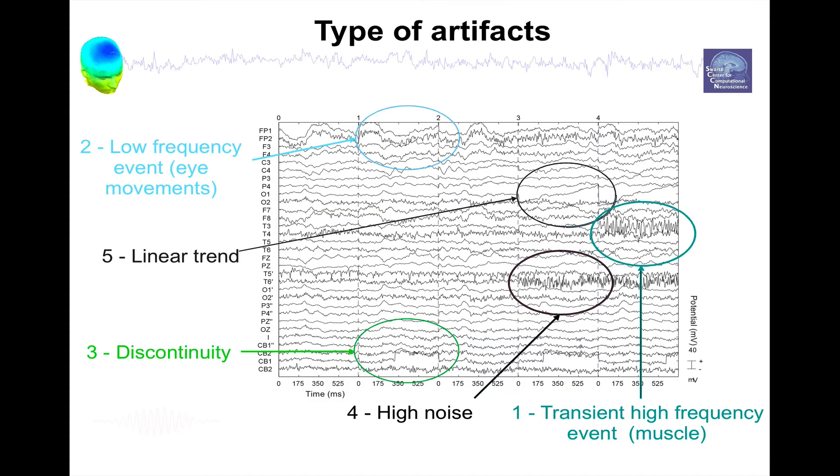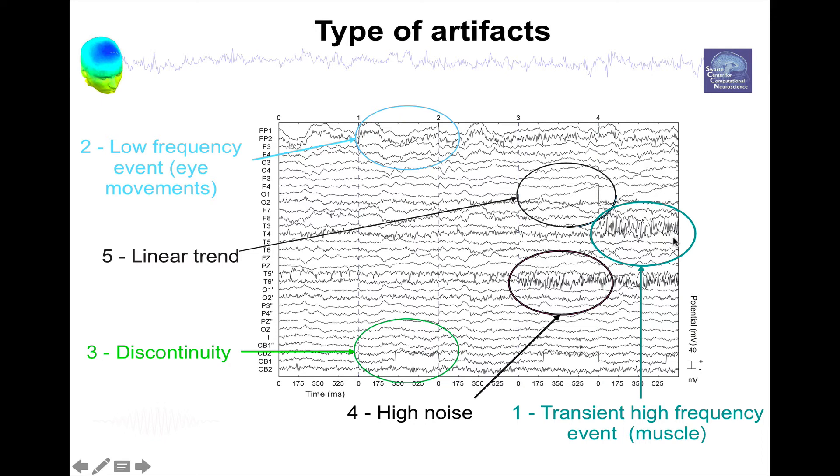There are many types of artifacts, here I'm just representing a couple. For instance, you can have high-frequency artifacts which can be muscle, especially at temporal electrodes. You can have low-frequency, for instance eye movements, or even when the eyes close you can have eye rollings.